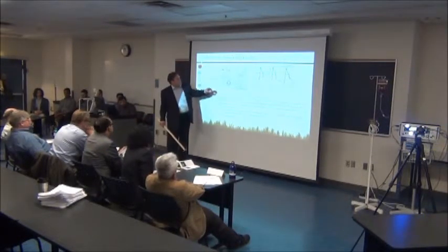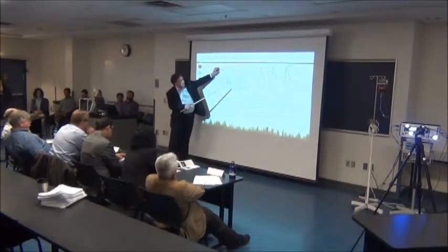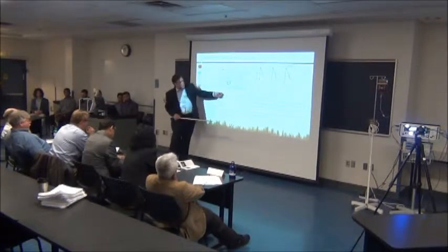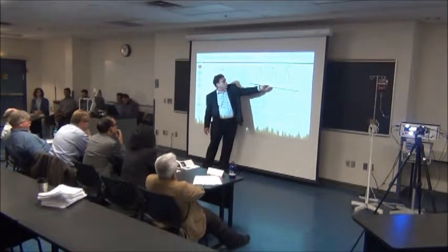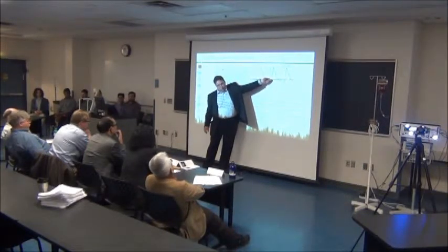So essentially what we do is we take this pump, we pressurize it till we read that it's 80 millimeters, and then we adjust the gain until we see the line come up, because it could start off here, or it could be here, and we use the adjustable gain to calibrate it right directly to 80.